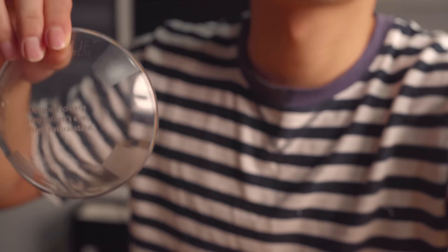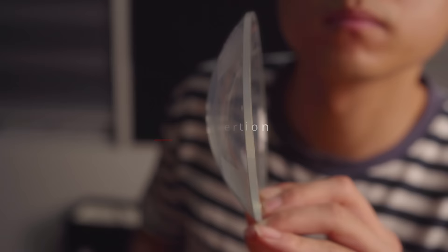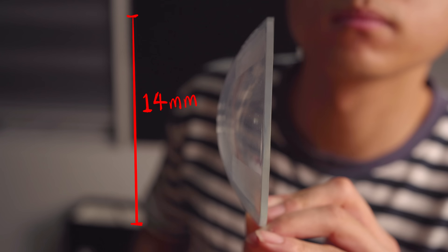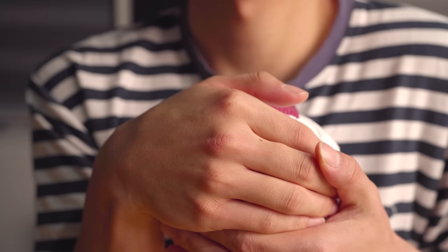Once we have inspected the lens, it's time to insert the lens into the eyeball. Step three, insertion. Contact lenses are usually about 14 millimeters in diameter, which means that for the lens to comfortably land on the eyeball, we will need to expand our eyelids wider than the lens itself.